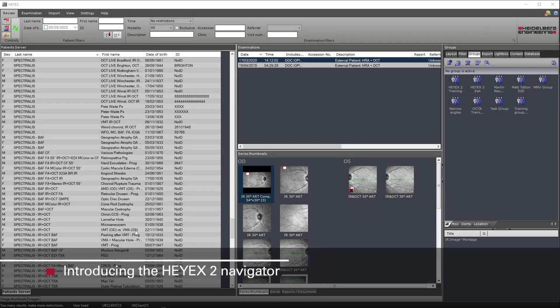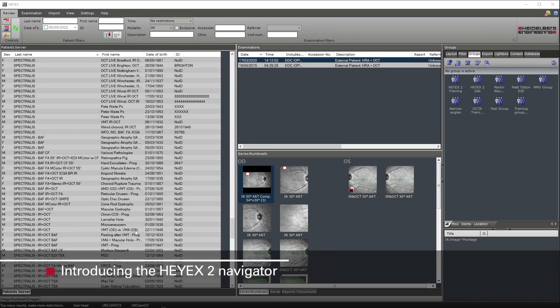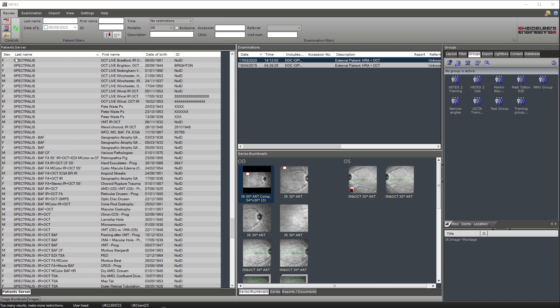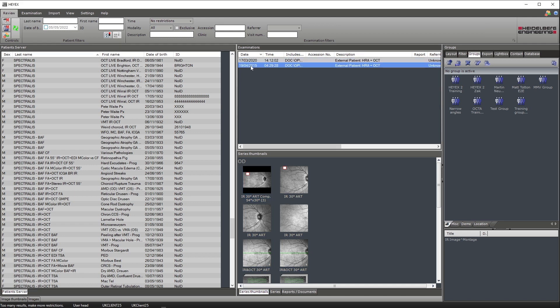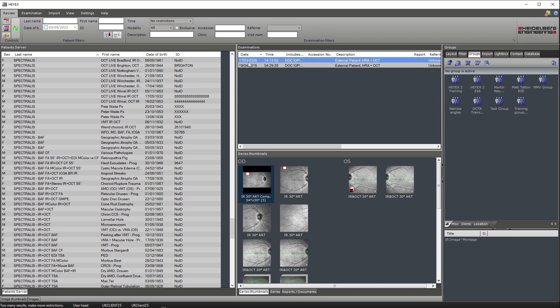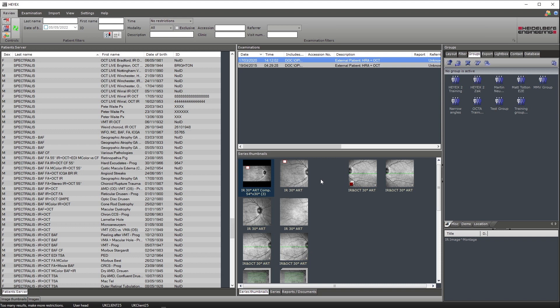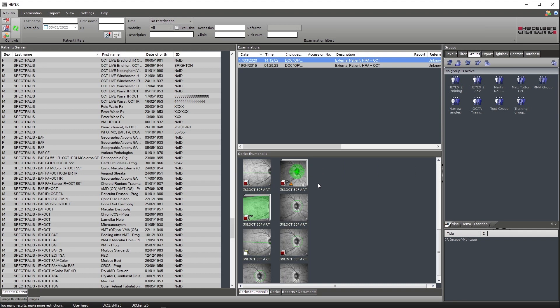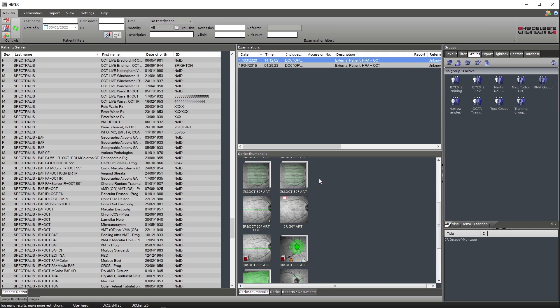This is the HiX2 Navigator. Within the Navigator at the top of the screen is our ribbon bar. Directly below the ribbon bar on the left hand side is the patient server, where all the patients will be displayed. To the right of the patient server is the examinations box. This is where each individual examination for a specific patient will be displayed. Underneath the examination box are the series thumbnails, which are the thumbnails for the scans that have been taken.